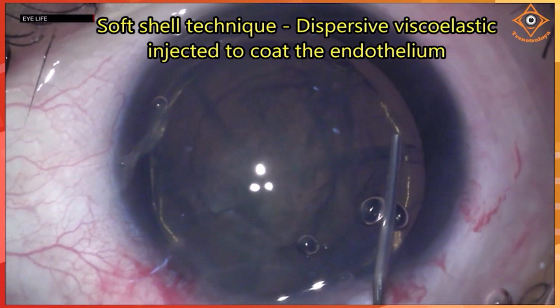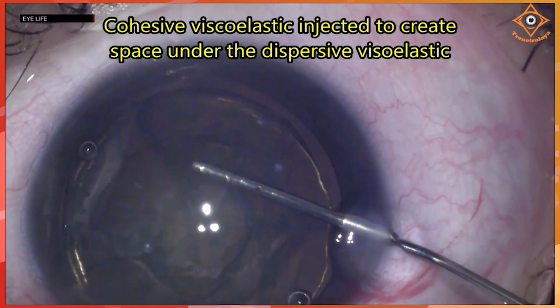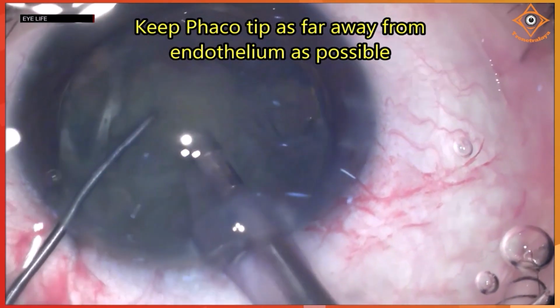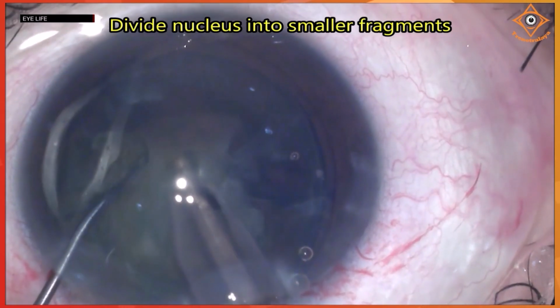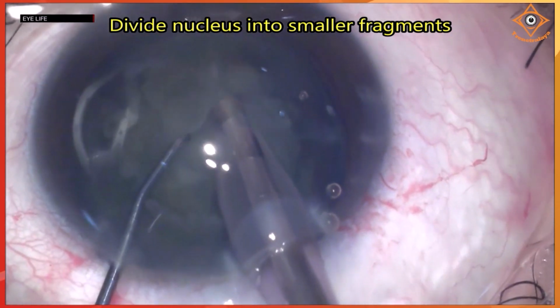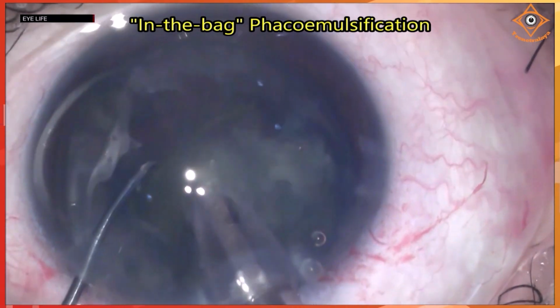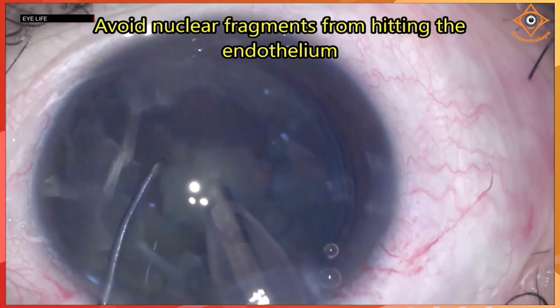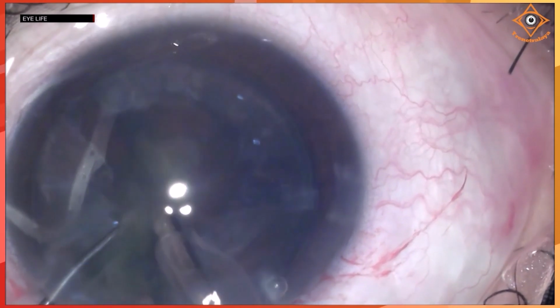The soft shell technique, as described by Dr. Arshinoff: first a dispersive viscoelastic to coat the endothelium, followed by a cohesive viscoelastic under the dispersive viscoelastic. Keep the phaco tip as far away from the endothelium as possible. Divide the nucleus into smaller fragments so that they don't touch the endothelium and cause endothelial damage. As much as possible, go for in-the-bag phacoemulsification. Avoid nuclear fragments running around in the AC and hitting the endothelium.